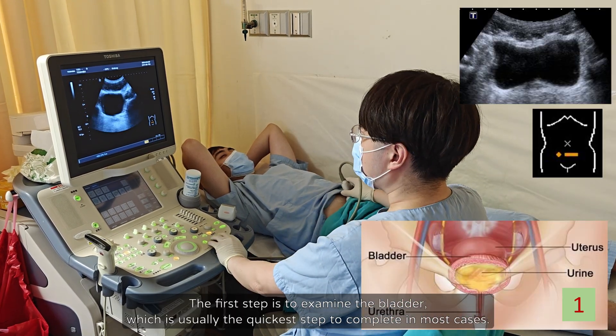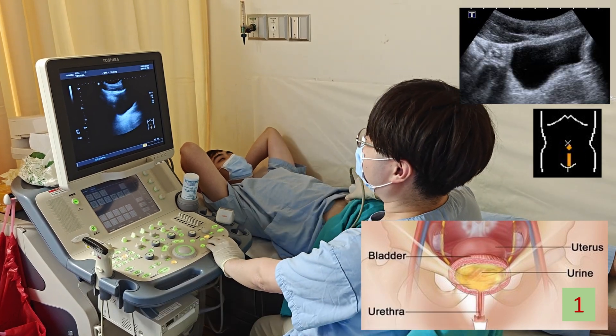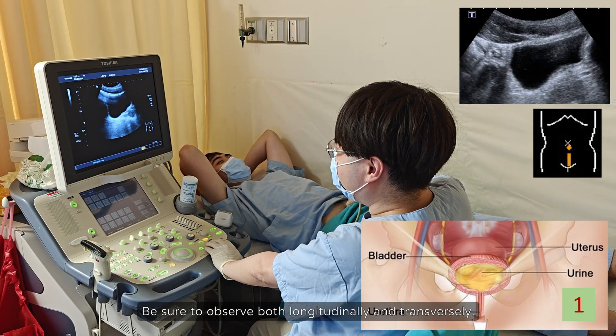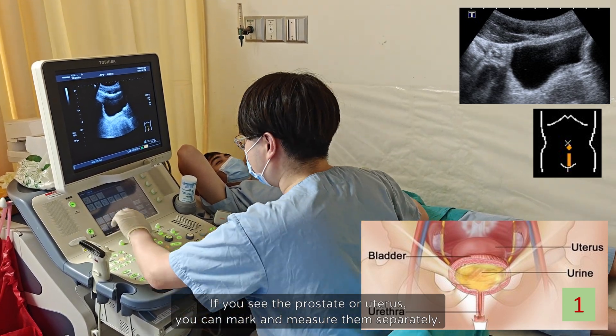The first step is to examine the bladder, which is usually the quickest step to complete in most cases. Be sure to observe both longitudinally and transversely. If you see the prostate or uterus, you can mark and measure them separately.